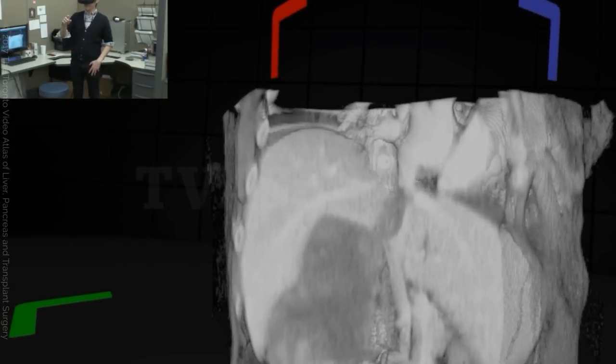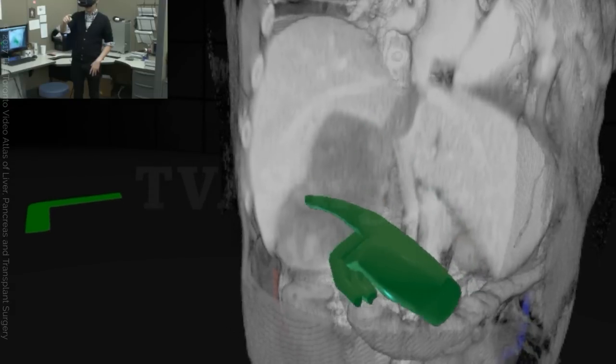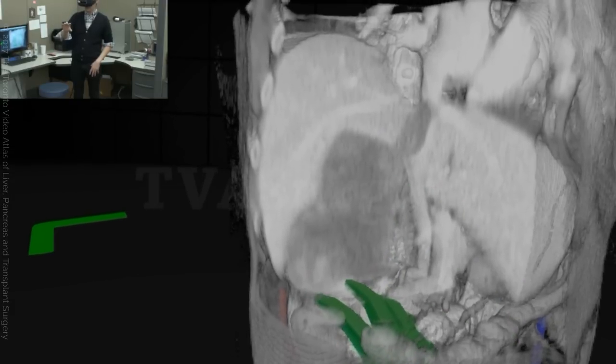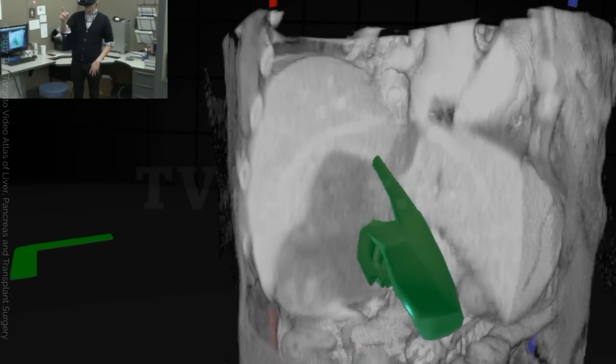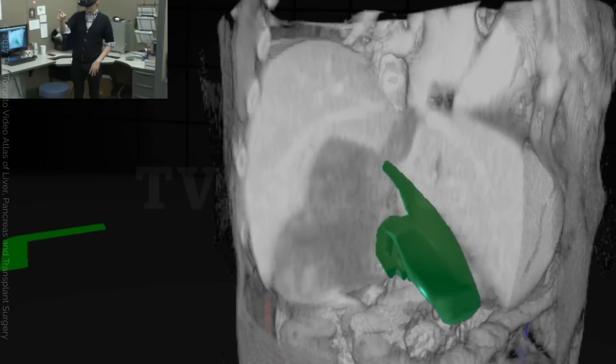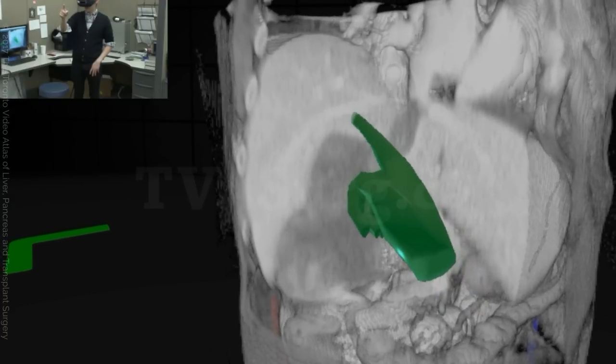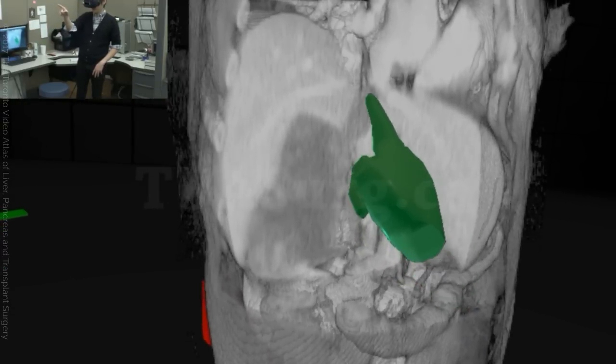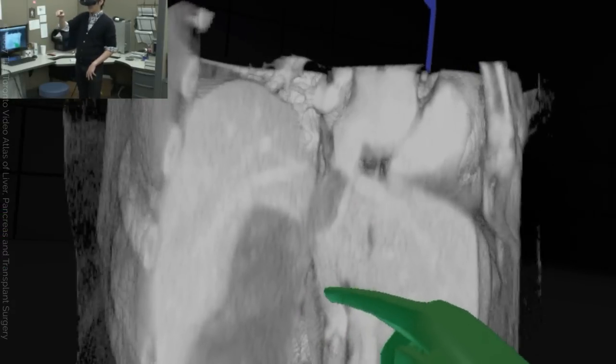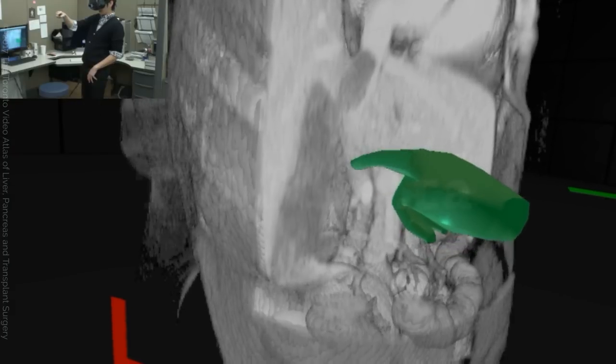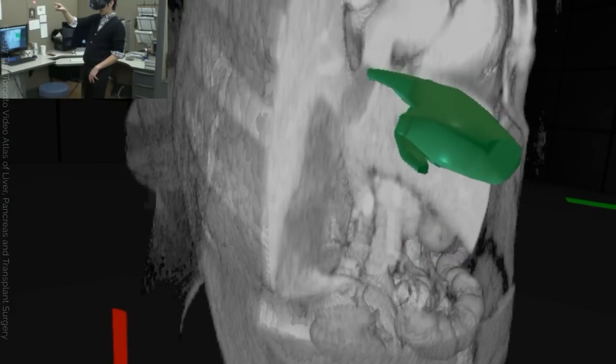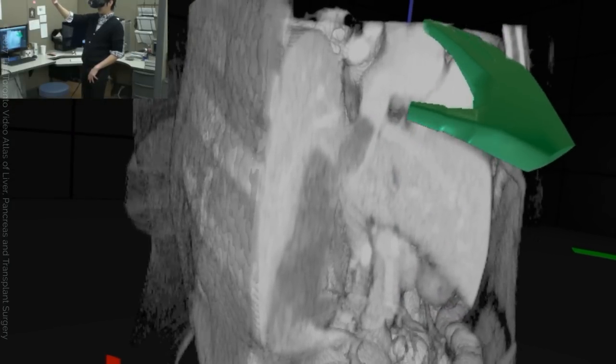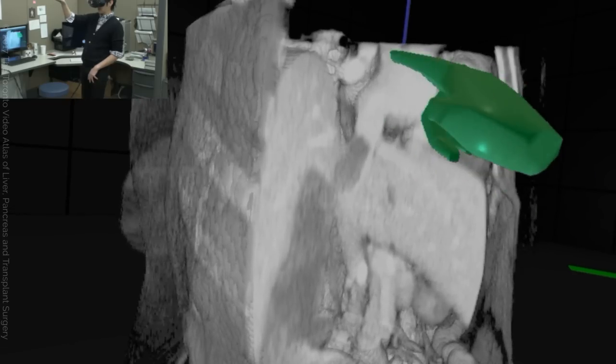So again, here's the big tumor mass above the right kidney. We can see that it starts invading the vena cava, close proximity to the right hepatic vein and the middle hepatic vein here. If we shift it, we can actually see the course of the vena cava, leading to the heart, and specifically the right atrium of the heart.